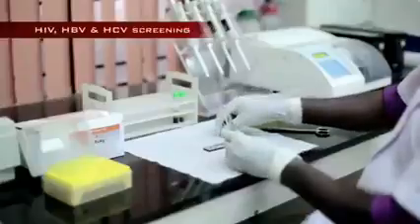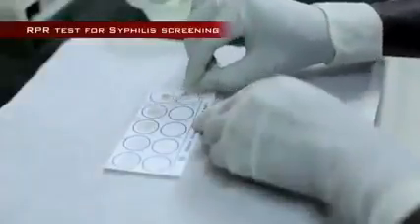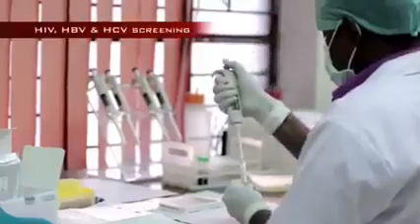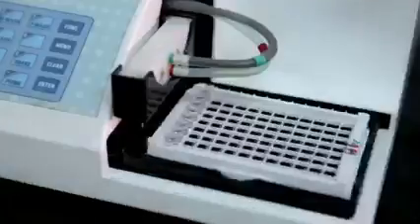This video describes the ELISA and rapid testing methods for HIV, HBV and HCV screening, smear tests for malaria screening, and the RPR test for syphilis screening. HIV, HBV and HCV are routinely screened by ELISA tests which detect anti-HIV antibodies, HBV surface antigen and anti-HCV antibodies.